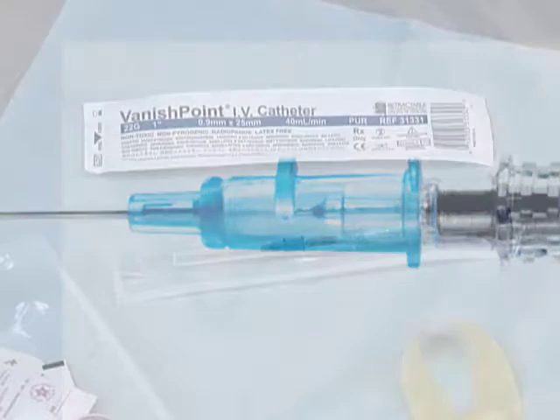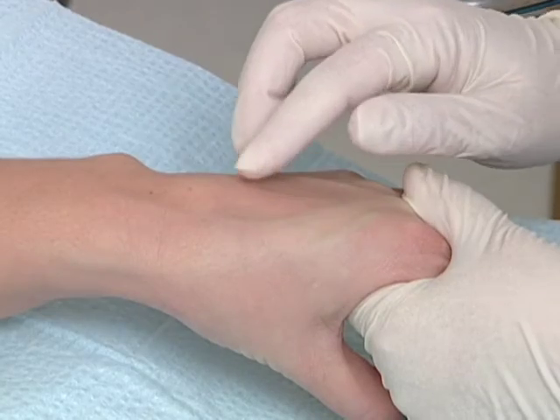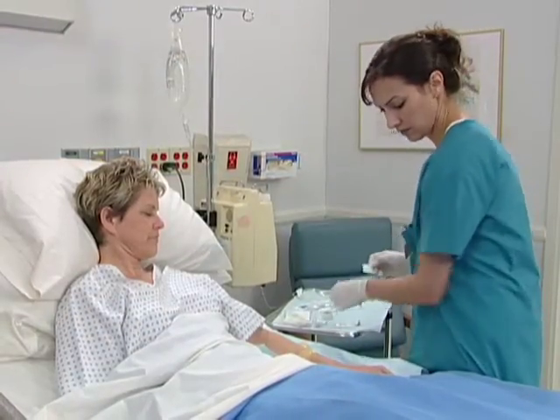Retractable Technologies has developed the Vanishpoint IV catheter to answer the demand for a safer IV device and meet OSHA's criteria for an engineered sharps injury prevention device.